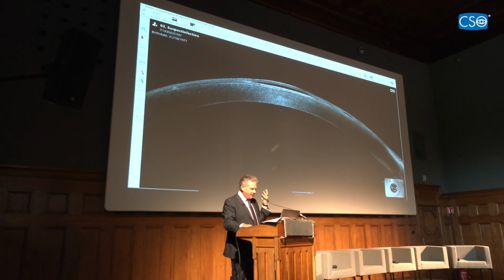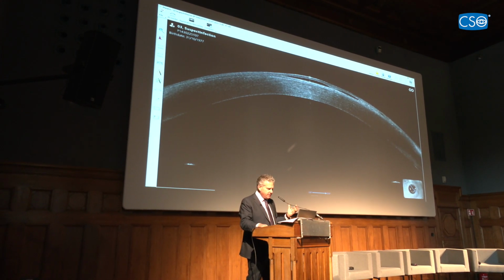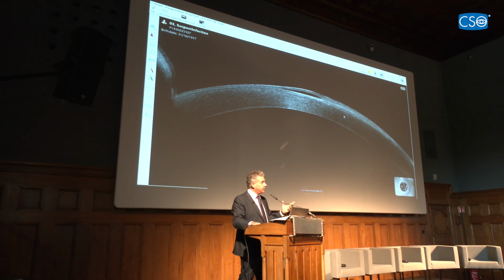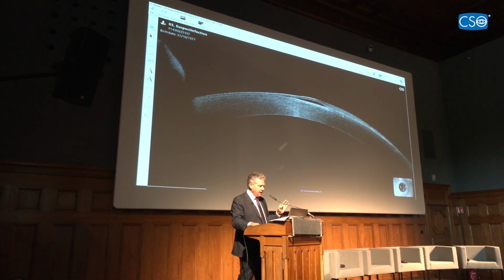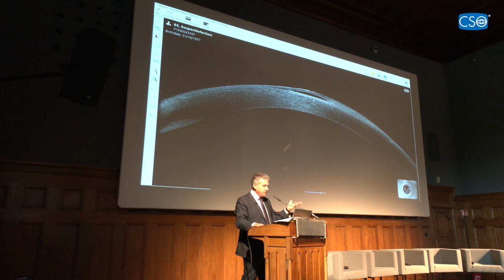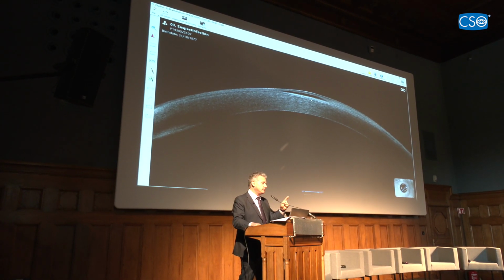Why? Because I have a bullous epithelium, okay? I have a bullous epithelium, and I can see that there's absolutely nothing going on in the deep stroma. Nothing. It's clear as a whistle. And I'm pretty confident that the excess backscatter from here is not scar.